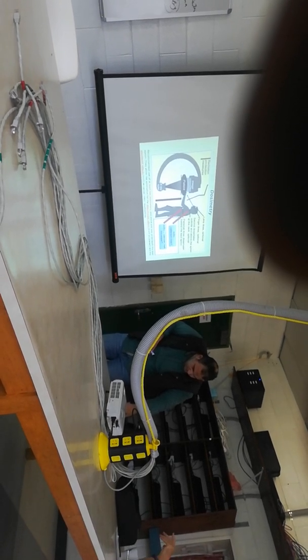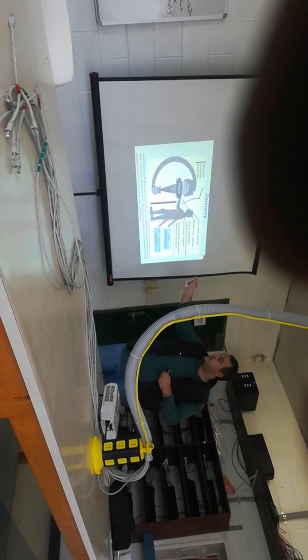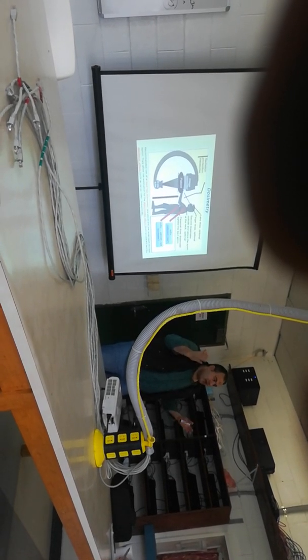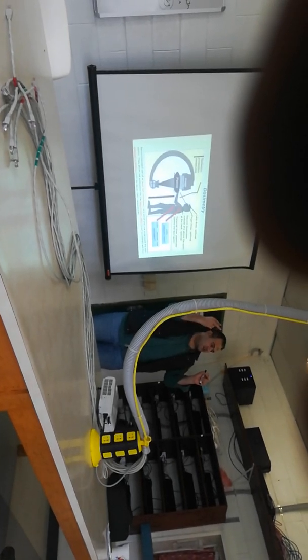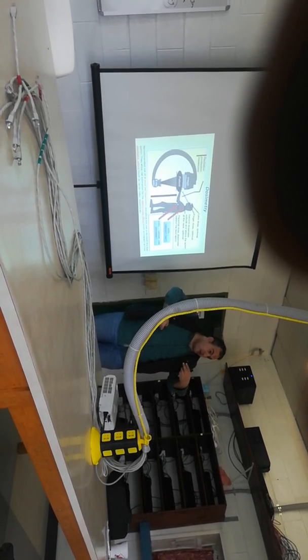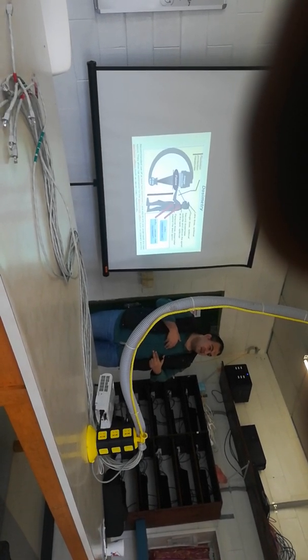So it would measure the absorbed dose. This is the effective dose of the patient, because for X-ray and gamma ray the quality factor is 1. So there is no difference between the absorbed dose and the effective dose for gamma ray or X-ray. So here, you have to wear at least 2 personal dosimeters. If there is a heavy workload, you have to wear one under the lead apron and one above, at least.